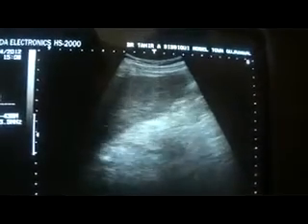This is again the same patient with cirrhotic liver. The left lobe of the liver is being seen in a longitudinal section, and here when I tilt the probe, you can see the caudate lobe of the liver with the IVC crossing its posterior border.